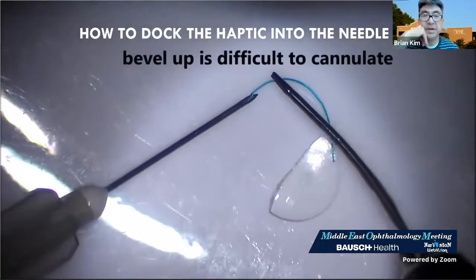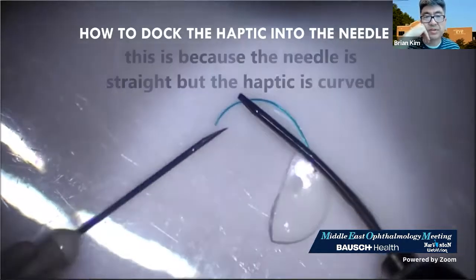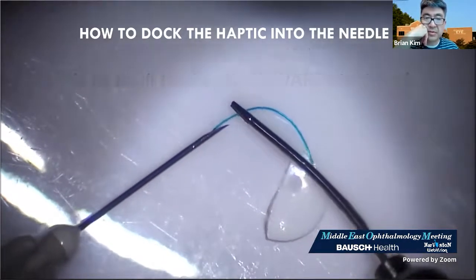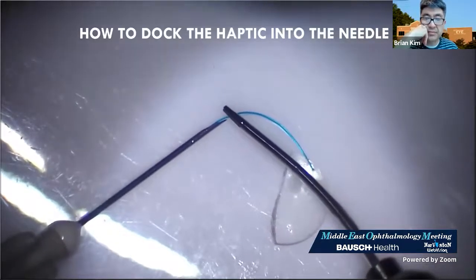So here the bevel is up, it's not working. Bevel is toward you, it's not working. Bevel down, but then bevel towards the haptic here. You can dock the haptic towards the bevel, flatten it out, straighten it out, and then you can advance the haptic in the needle.